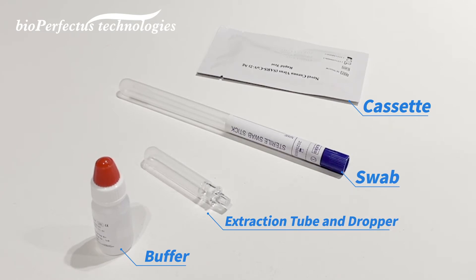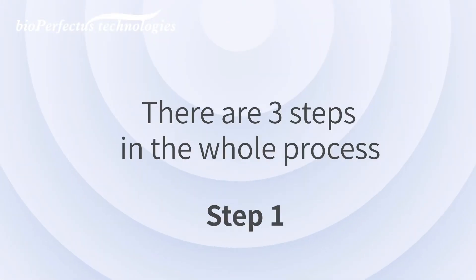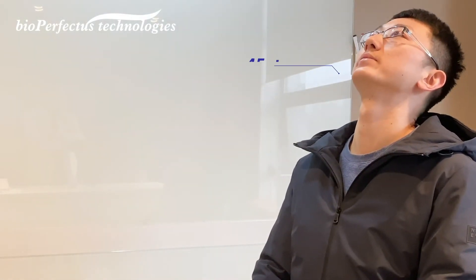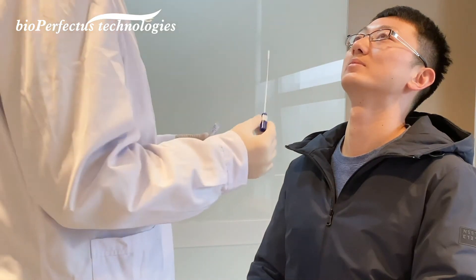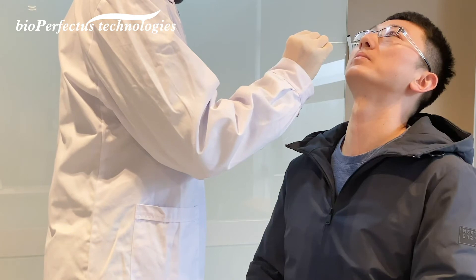Step one: subjects are asked to sit straight with their heads tilted up at 45 degrees. Take out the swab from the protective jacket. Insert the swab through the nostril parallel to the palate until resistance is encountered.